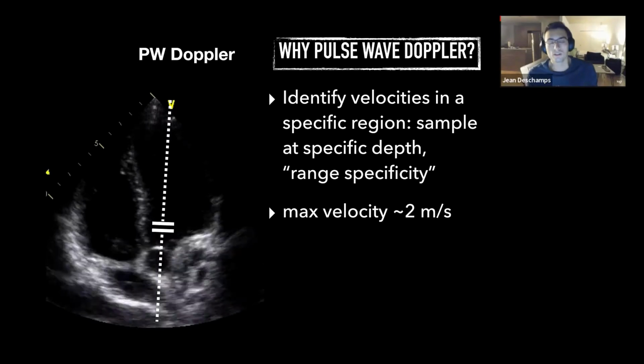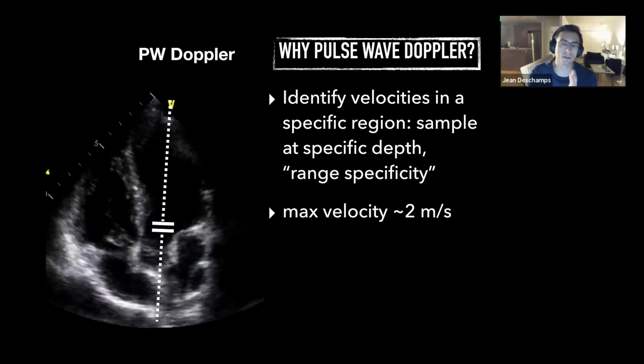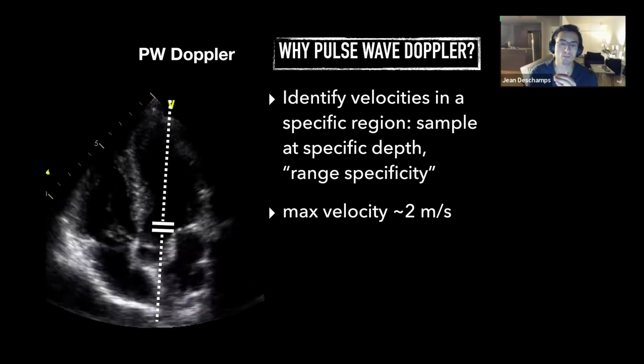Yeah, and one of the things I think we need to mention about spectral Doppler is that because it's a single line over time, the temporal resolution is much better.